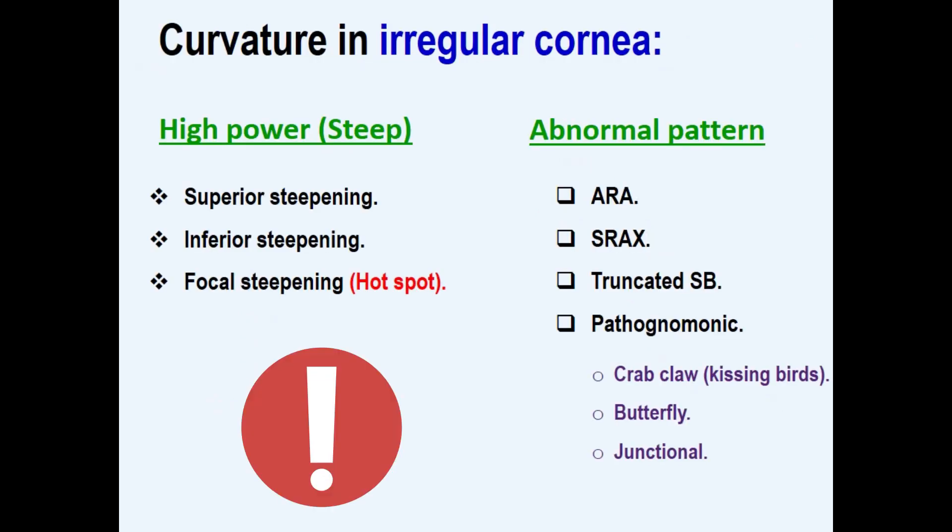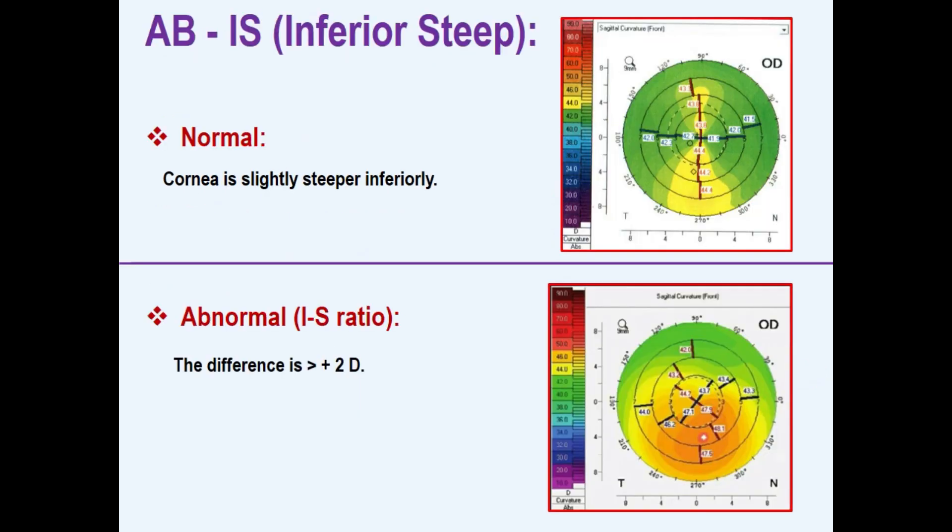What are the topographic signs of irregularity? Irregularity can present as abnormal power or abnormal pattern. The asymmetric bowtie inferior steep. Normally, the cornea is slightly steeper inferiorly. The infero-superior difference should not exceed plus 2 diopters at the middle circle. Abnormal inferior steepening is the common pattern in keratoconus.